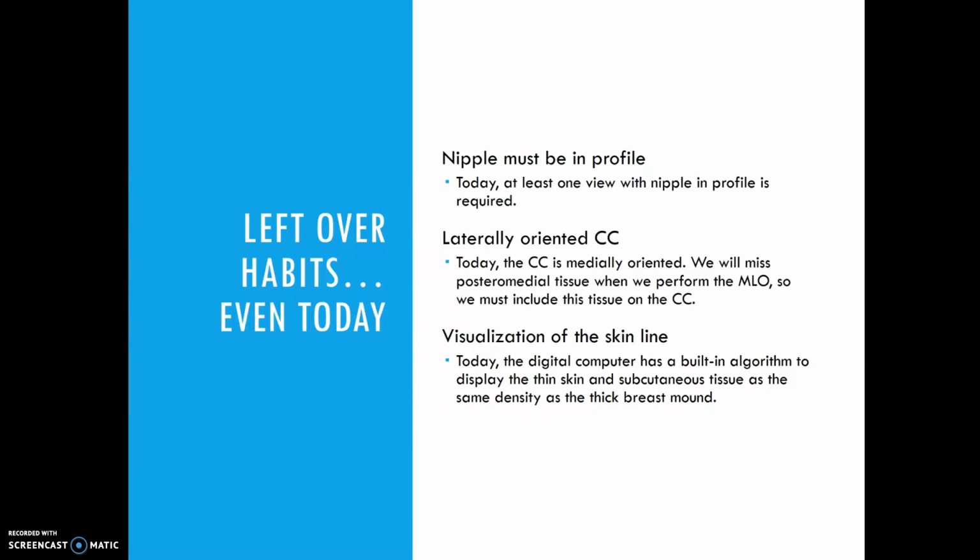That got fixed with digital mammography now, because they have algorithms that can display the skin and subcutaneous tissue, as well as make sure that you're penetrating the breast mound.